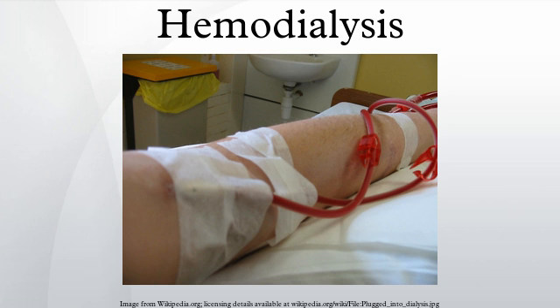Hemodialysis often involves fluid removal, because most patients with renal failure pass little or no urine. Side effects caused by removing too much fluid and/or removing fluid too rapidly include low blood pressure, fatigue, chest pains, leg cramps, nausea and headaches. These symptoms can occur during the treatment and can persist post-treatment. They are sometimes collectively referred to as the dialysis hangover or dialysis washout.